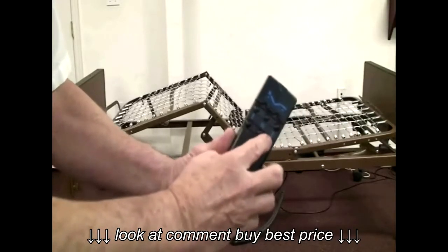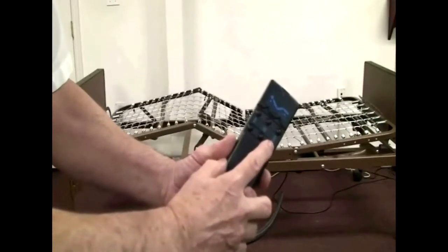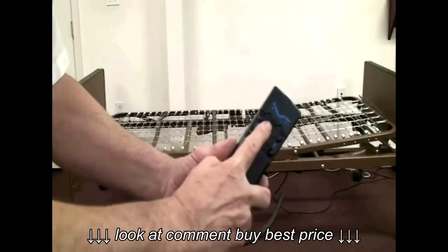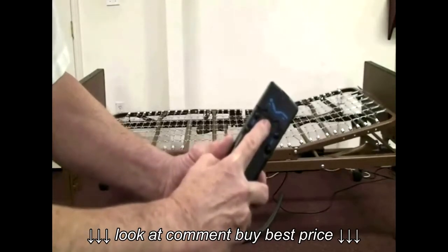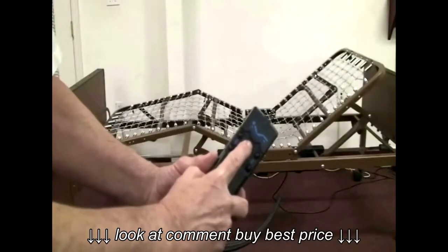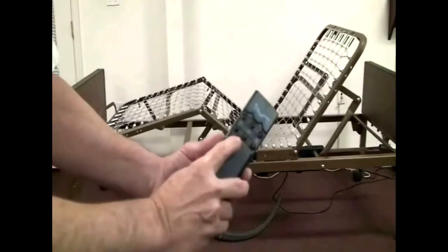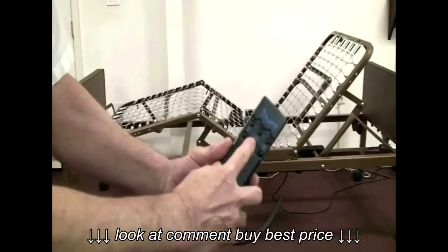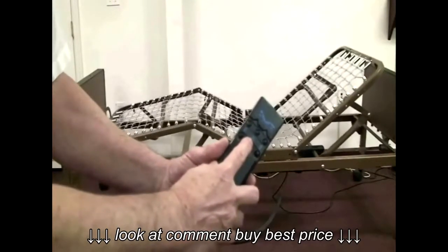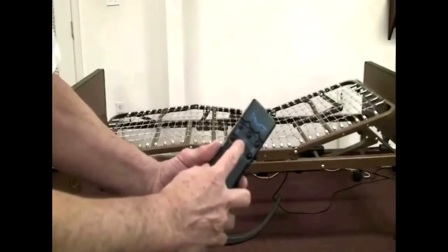And it stands to reason that if we push the bottom button under the picture of the foot section, the foot section will go down. If we push the top middle button, the head and foot section both go up, and if we push the bottom middle button, the head and foot section will both go down. Pretty logical.